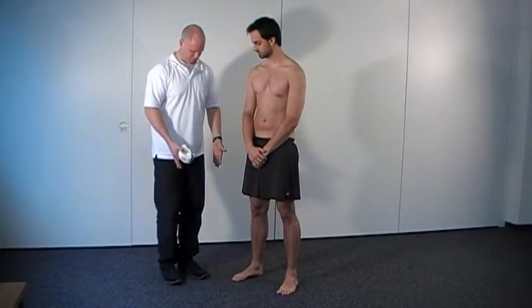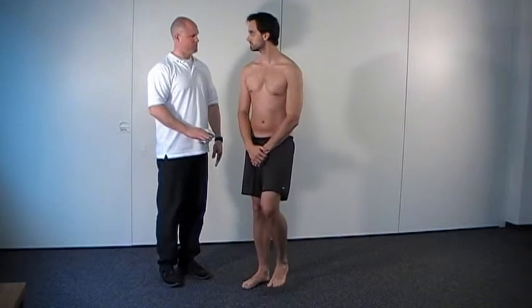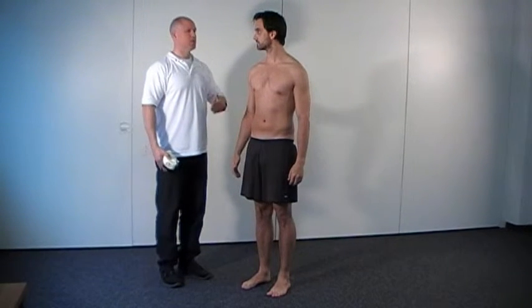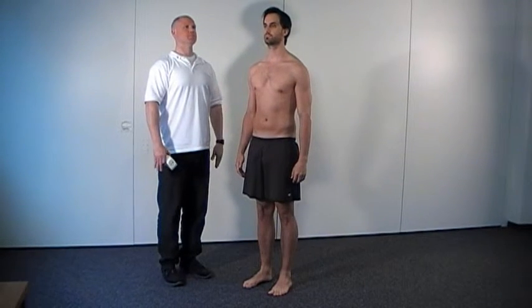Stand with feet about hip-width apart. Distribute body weight evenly on both feet. The knees should be straight. The arms should be allowed to hang freely at the sides of the body. The patient should adopt their habitual posture. Look straight ahead.